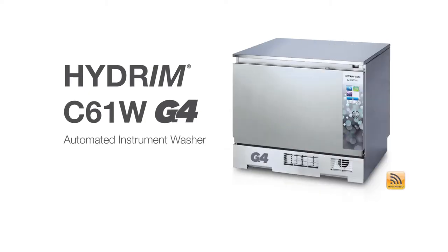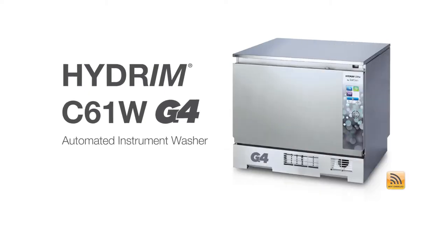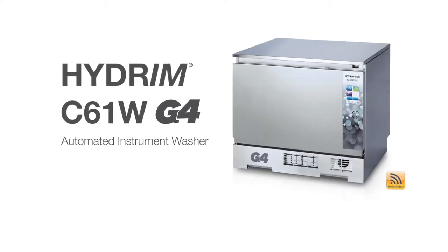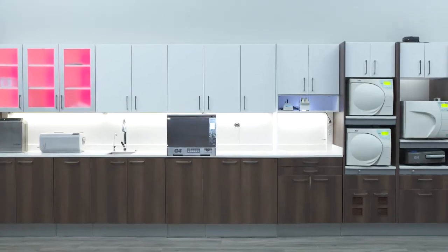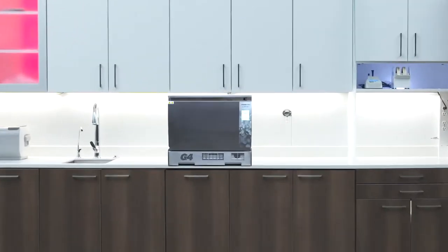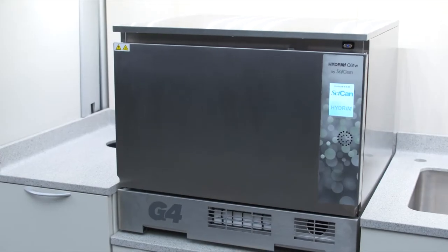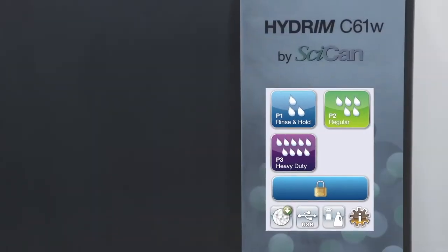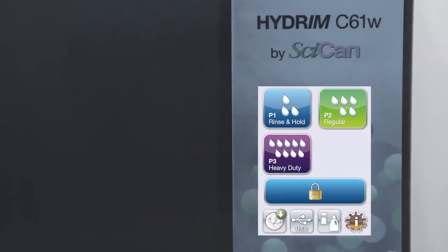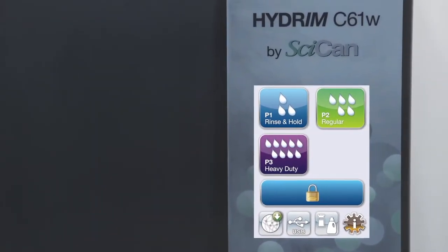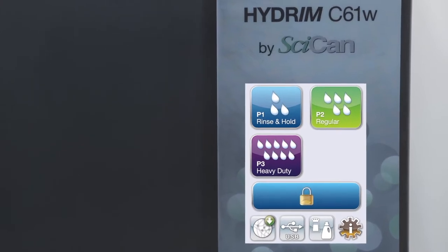Thank you for adding Sycan Hydrum C61 instrument washer to your practice. This compact tabletop or under counter automated instrument washer with a responsive 3.5 inch touchscreen provides a safe, effective, and efficient way to clean instruments.